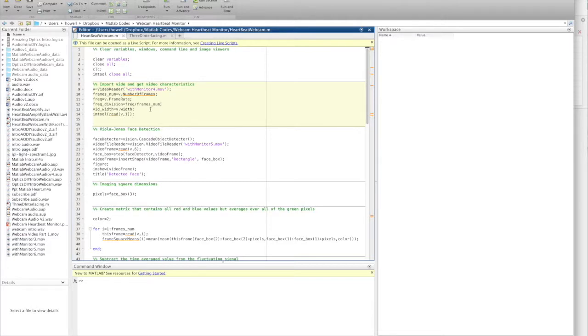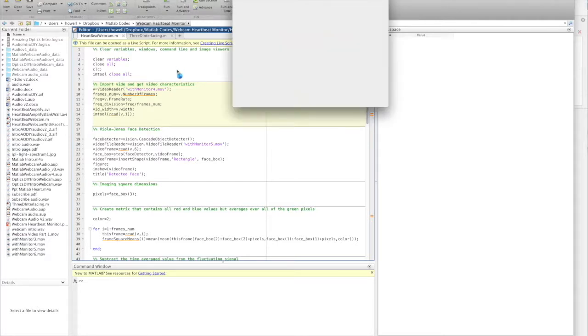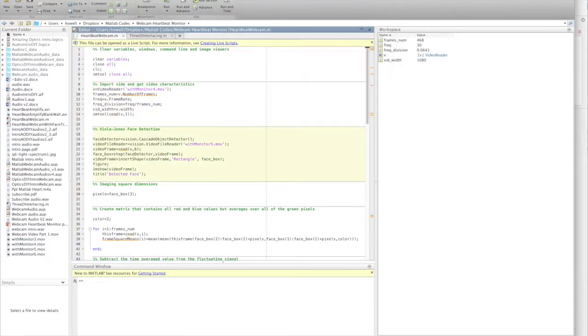Lastly, we open an image viewer that shows the first frame of the video. Let's run in advance. In this section, we use a computer vision package that uses the Viola-Jones face detection algorithm to find the region where we are interested in analyzing the heartbeat.